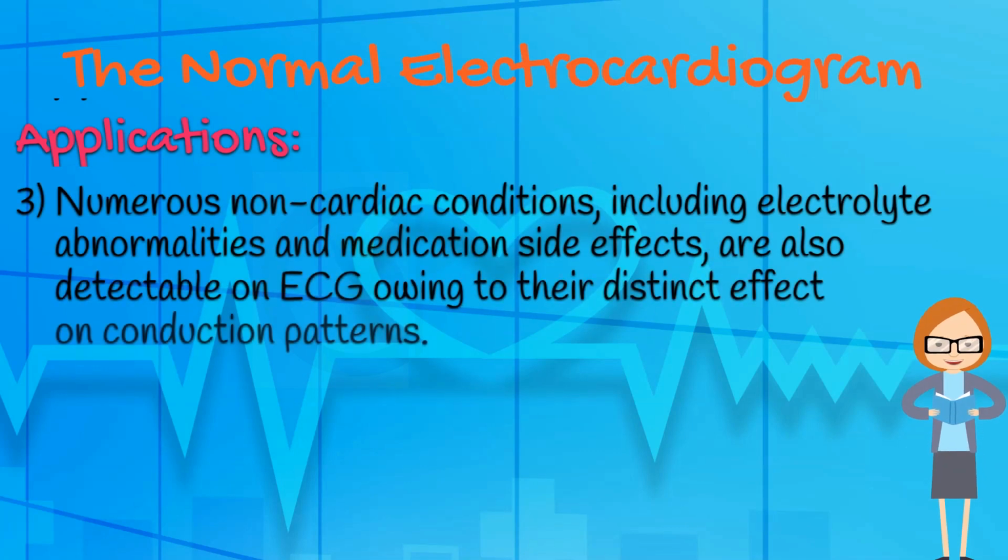Numerous non-cardiac conditions, including electrolyte abnormalities and medication side effects, are also detectable on ECG, owing to their distinct effect on conduction patterns.